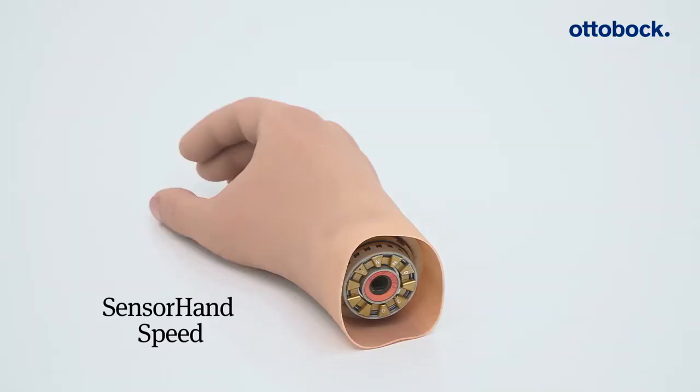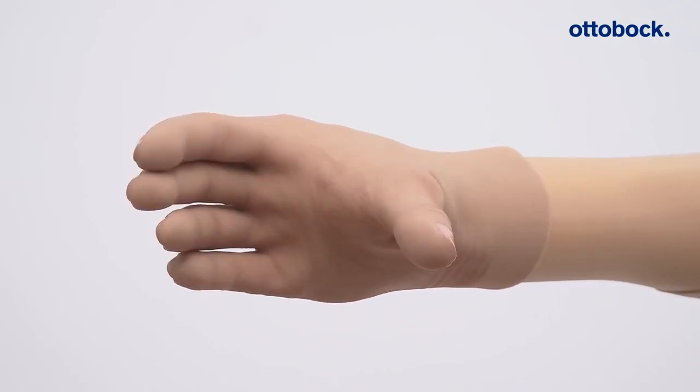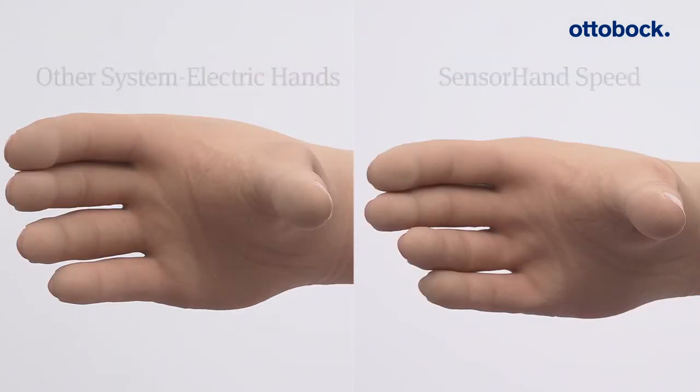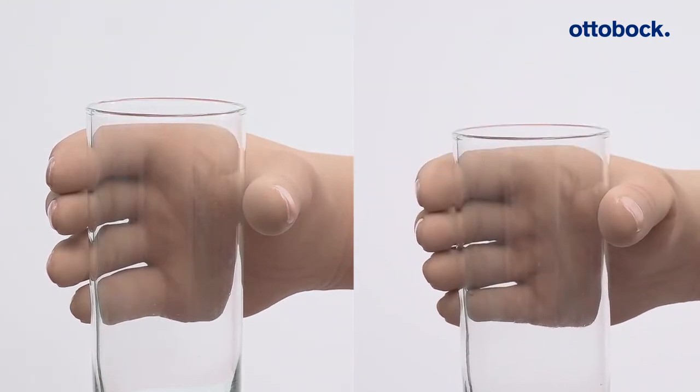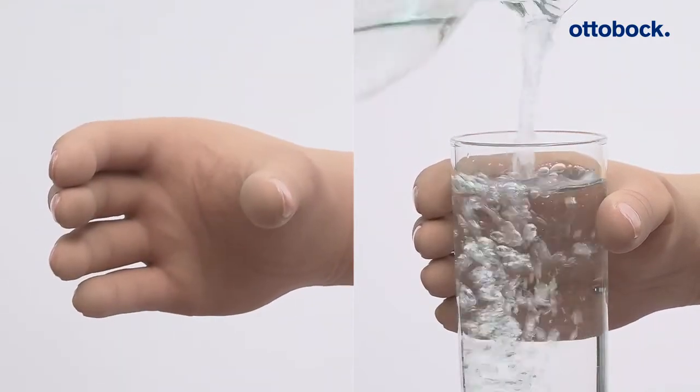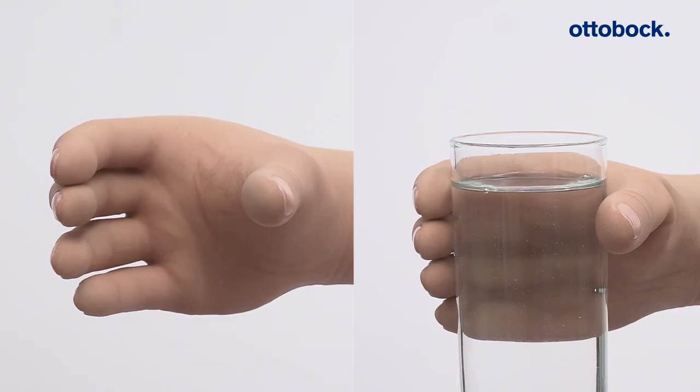The Sensor Hand Speed offers the same functionality as the VariPlus Speed hand. The Suva sensor technology integrated into the thumb instantly senses when a gripped object is about to slip. The Sensor Hand Speed sets new standards in terms of precision, speed, and safety.